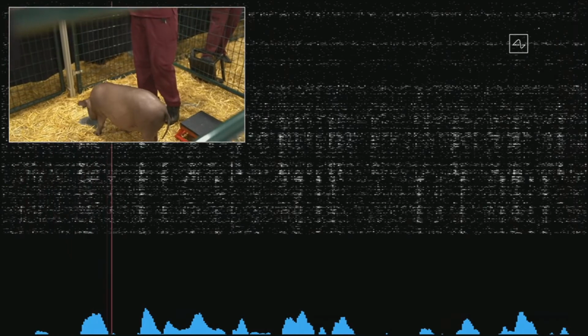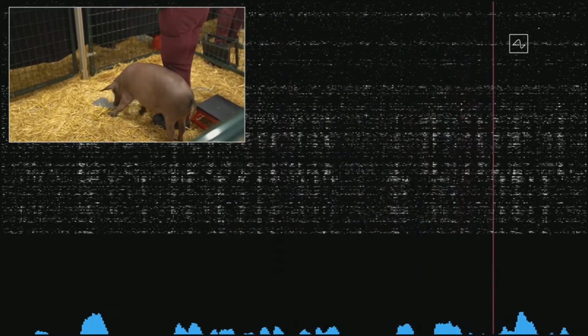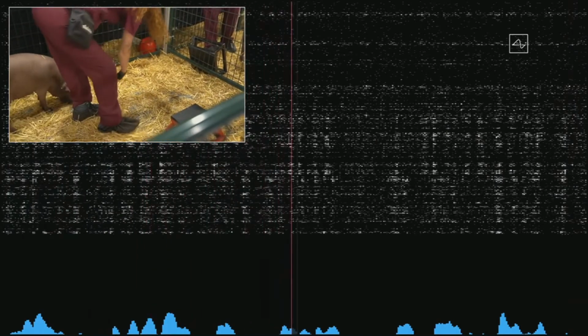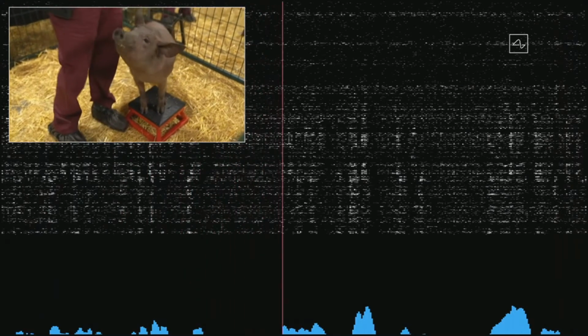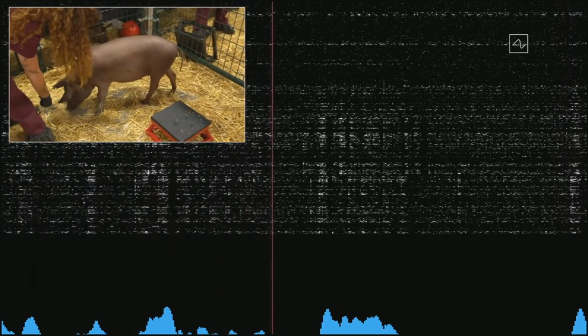So the beeps you're hearing are real-time signals from the Neuralink in Gertrude's head. This Neuralink connects to neurons in her snout, so whenever she snuffles around and touches something with her snout, that sends out neural spikes, which are detected here. On the screen, you can see each of the spikes from the 1,024 electrodes. If she touches her snout to the ground, or you feed her some food, pigs love food, then you can see the neurons fire much more than when you're not touching the snout. That's what's making the beeping sound.